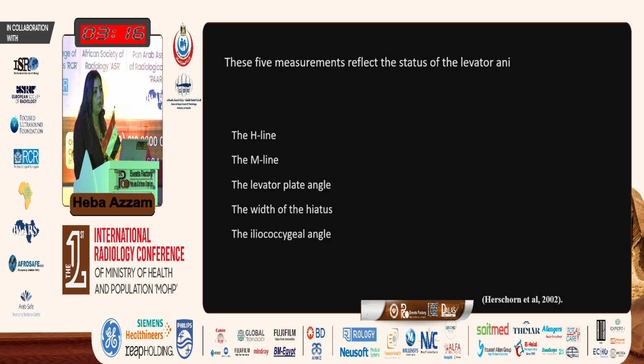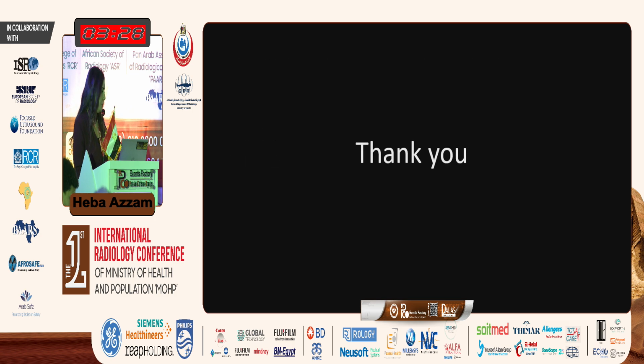We combine the findings from the static images and the dynamic images to see if there is specific anatomical defect causing certain functional abnormality. Thank you so much.